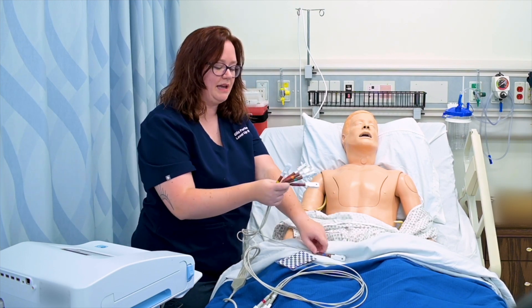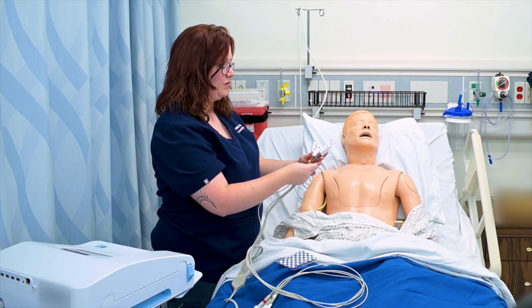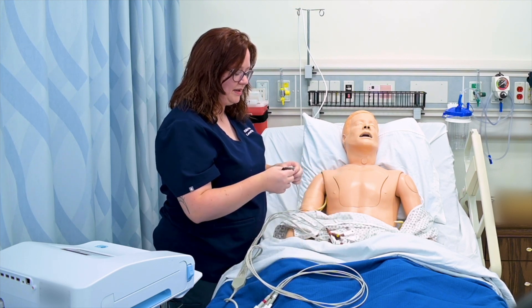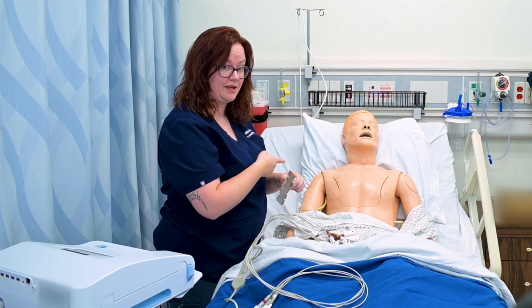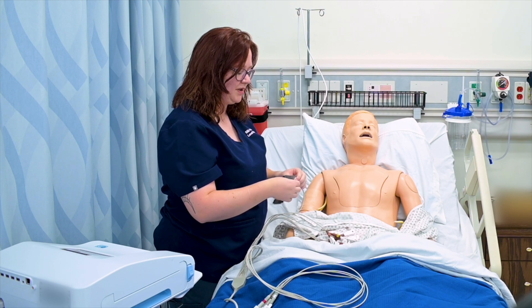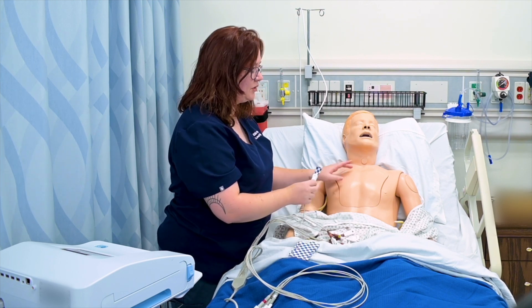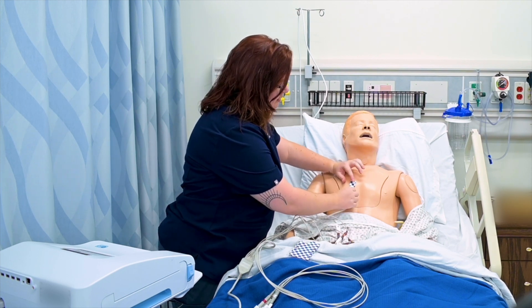Your leads are all labeled V1 through V6, so I need to rifle through them and find V1. V1 is going to be placed on the right — and when I say left and right, I mean the patient's left and right. So don't forget, I'm working with the patient's left and right. I'm going to place V1 in the fourth intercostal space to the right of the sternum.